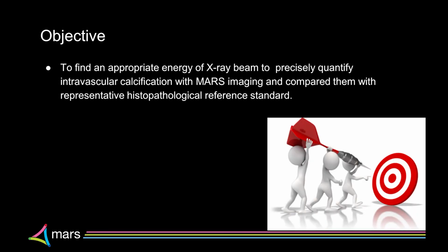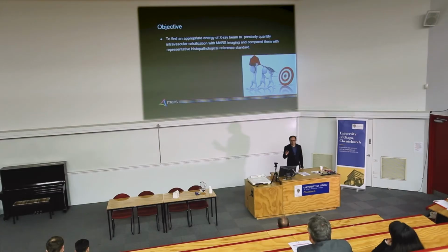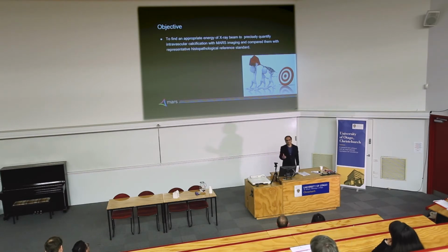Thus, the objective of my study is to identify an appropriate energy of the X-ray beam for the precise quantification of vascular calcification using MARS spectral photon counting CT, which can generate images in multiple spectra, and compare and validate them with the histopathological reference standard.